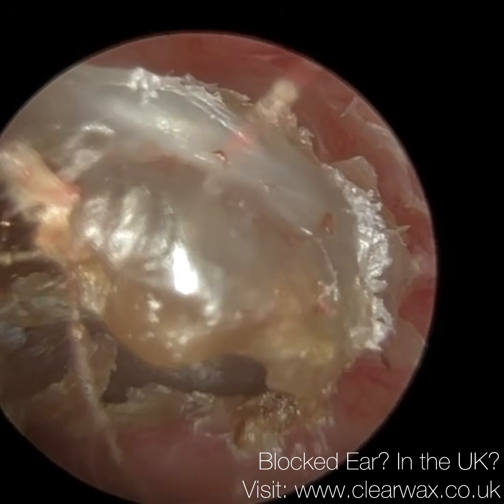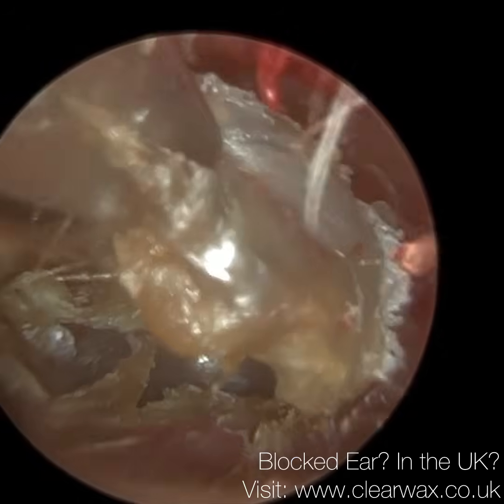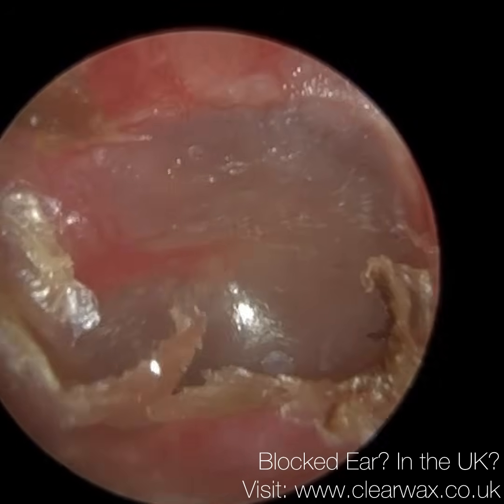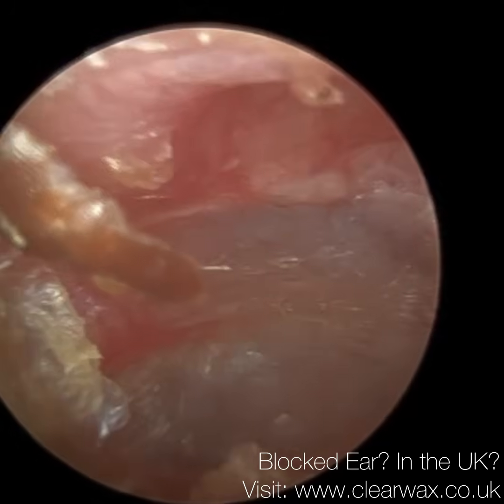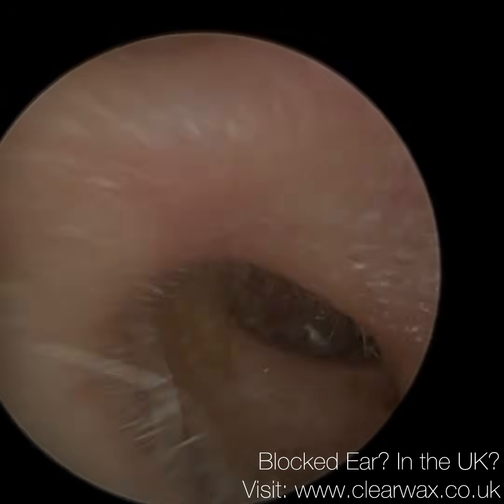And in cases of benign osteonecrosis, the best treatment really is just regular cleaning of the ear. Hence why this patient attends every year. And you can probably see the border of the old ear canal. You'll have some more views.